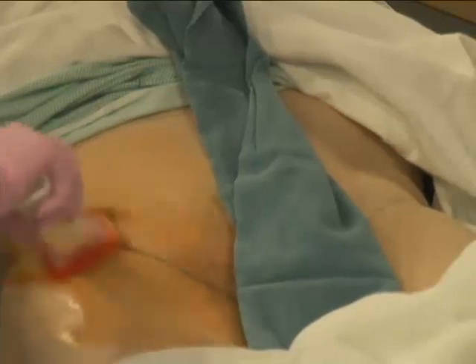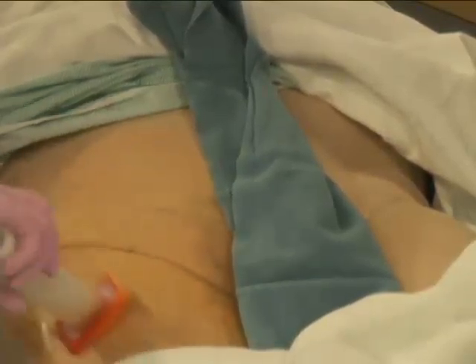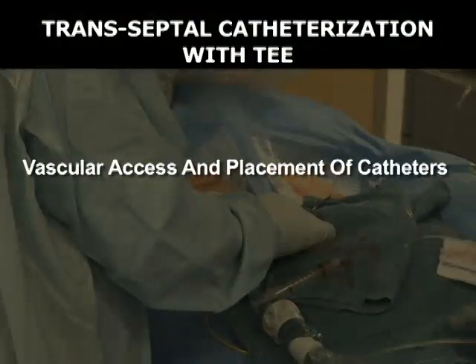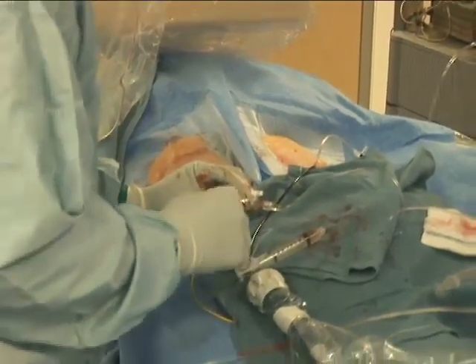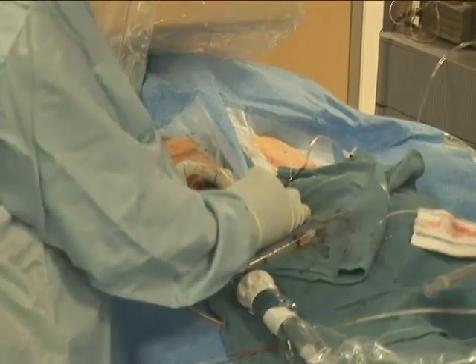Place the patient on the cardiac cath lab table. Prepare and sterilely drape both groins and one or other radial artery access if that site is to be used. Right femoral venous access is obtained using standard technique, and an 8 French sheath is inserted. Arterial access is commonly obtained as well.